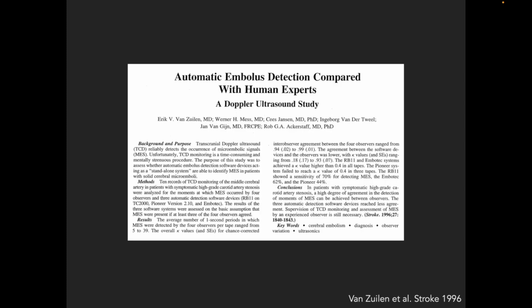There is hardly any paper where a given algorithm was evaluated independently or in comparison to other algorithms. This rather old publication showed rather low accuracies. So, if you want to use the automatic embolus detection software that might be implemented in your TCD system, please test it yourself under the circumstances you want to use the TCD machine for. Only that will determine whether you can use it in daily practice or not.